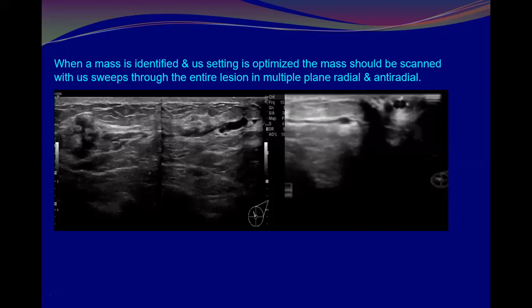What is the name of the technique for this image? I'm talking just about this part. Panorama.